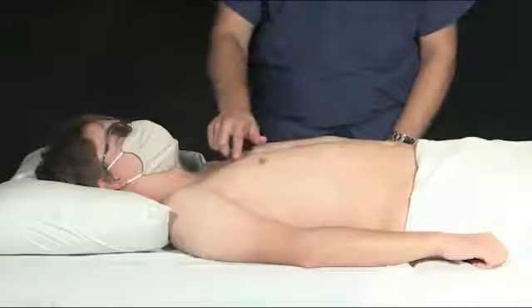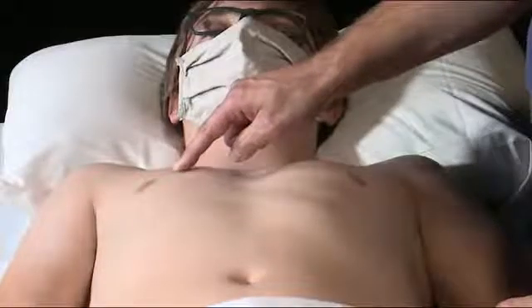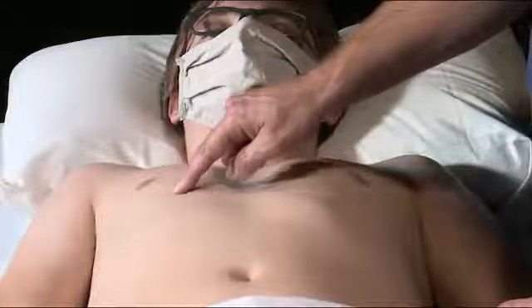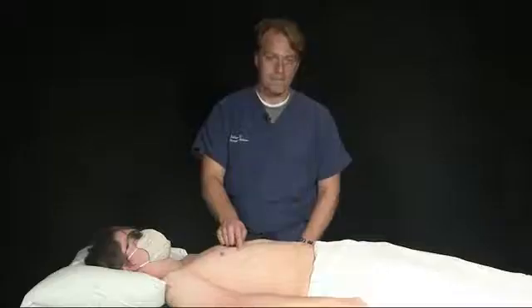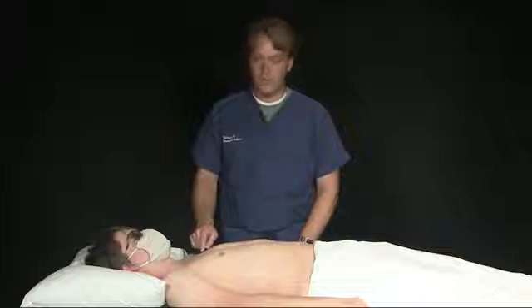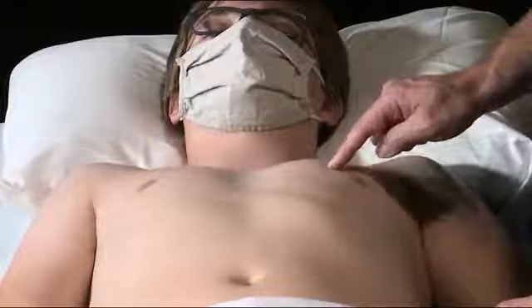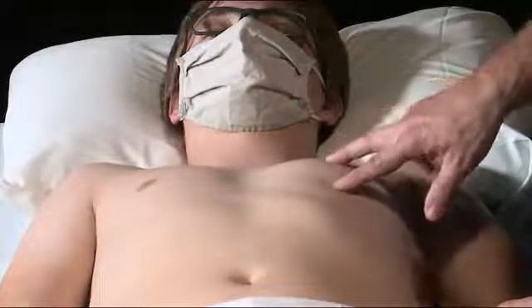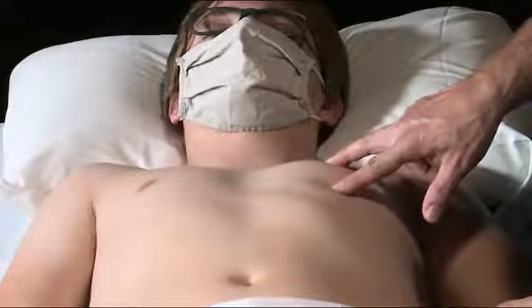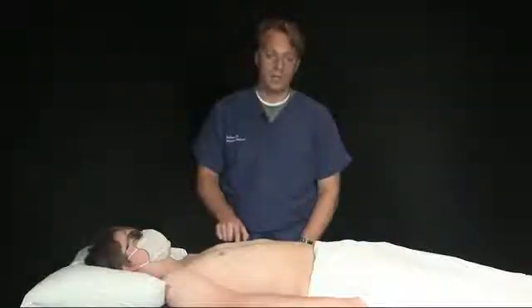We're going to take the transducer first just above the nipple and then drag it in the mid-clavicular line just below the nipple, looking for lung sliding. We're also going to repeat that same procedure on the left side. We'll image along the mid-clavicular line and put the transducer between the second and the fifth intercostal spaces, imaging as we slide down looking for lung sliding.